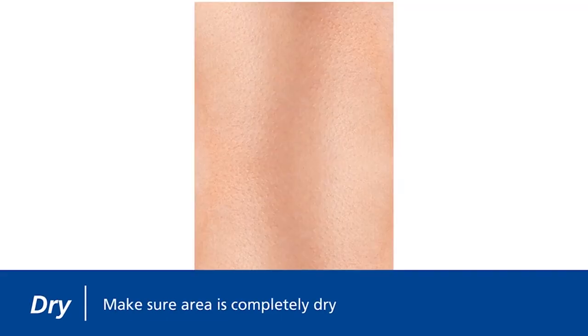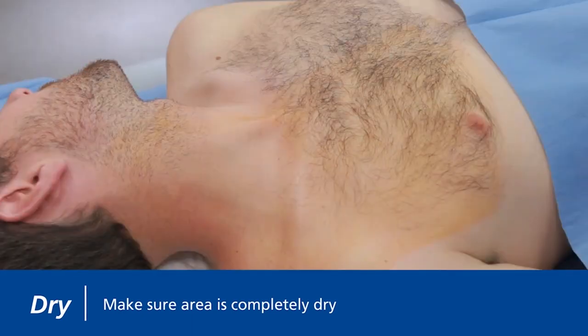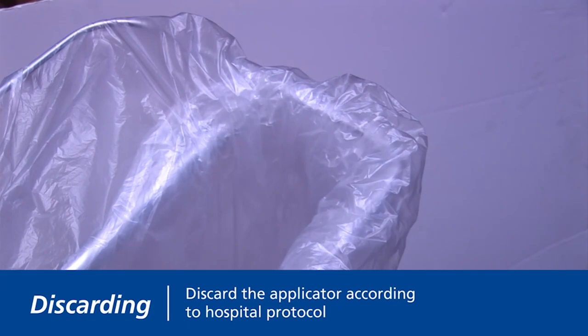As it dries, the sheen becomes less apparent and takes on a matte appearance. For optimal adhesion, make sure the area is completely dry before applying drapes or dressings. Your site is now prepped and ready. Discard the applicator after a single use.